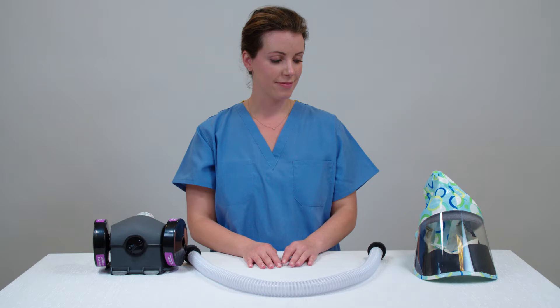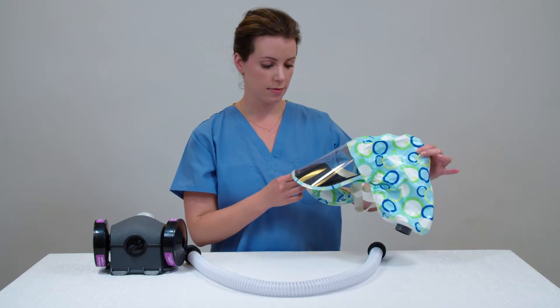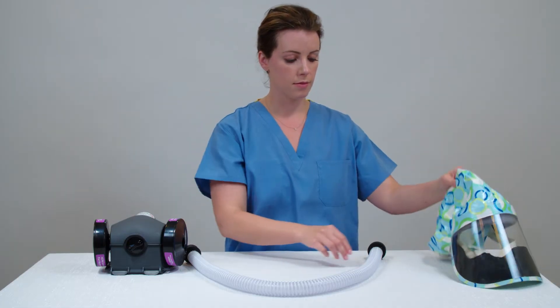Now let's watch how quick and easy it is to prepare and don the Sentinel XL HP system. Before using the system, perform an overall visual inspection of the unit. Start with a thorough inspection of the hood or head cover, ensuring that there are no nicks or tears in the product.